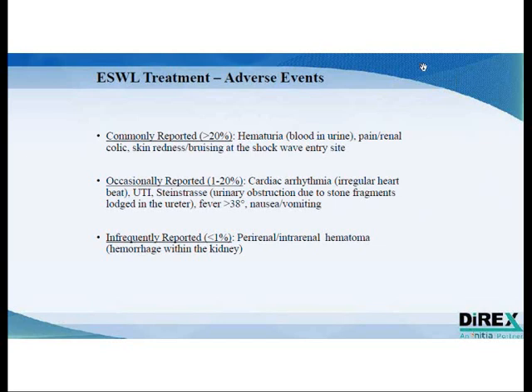ESWL is considered a relatively safe treatment. In part, this is due to the fact that the number of shock waves required go up to 3,000, and there are not many cases of severe adverse events. The most common ones are hematuria, blood in the urine. This is caused by the fact that the shock waves affect not only the stone but the soft tissue surrounding the stone. This, of course, is in the case of minimal damage.